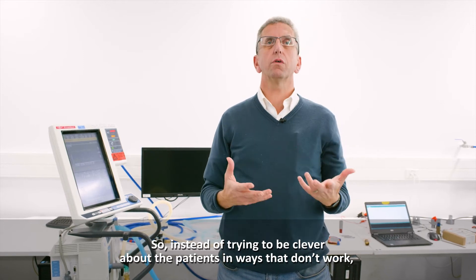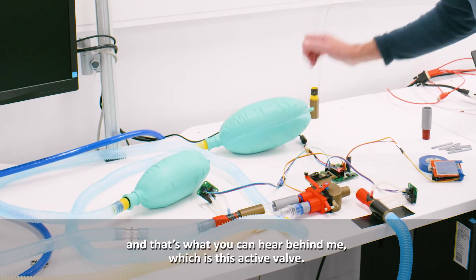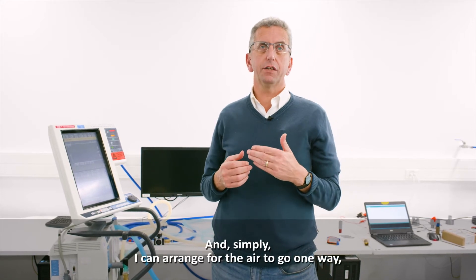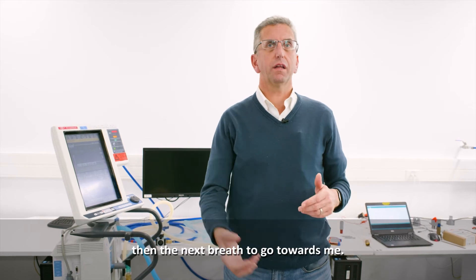Instead of trying to be clever about patients in ways that don't work, let's use a little bit of clever technology — and that's what you can hear behind me, which is this active valve. I can double the respiratory rate of the ventilator and arrange for the air to go one way towards you first, and then the next breath to go towards me.